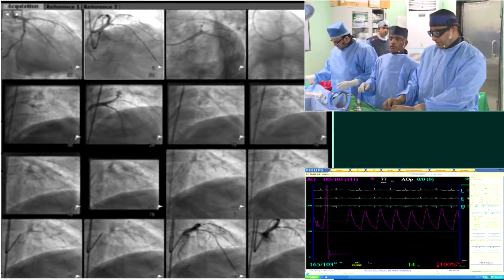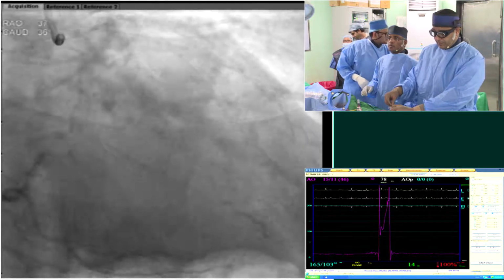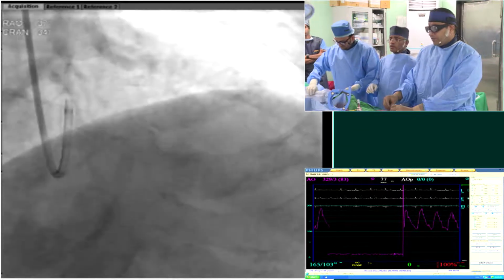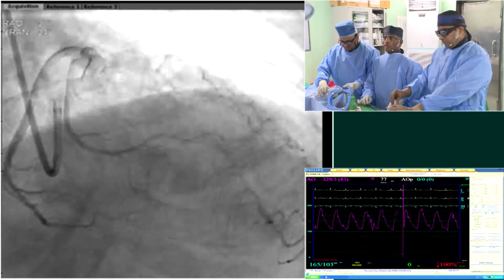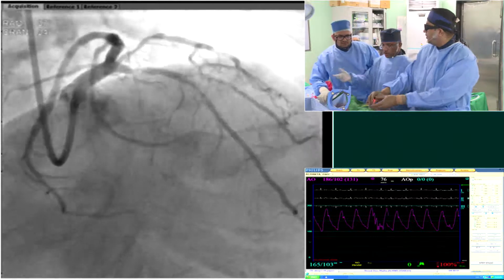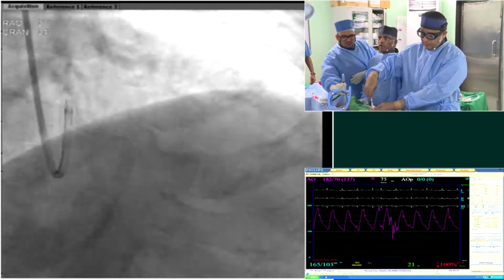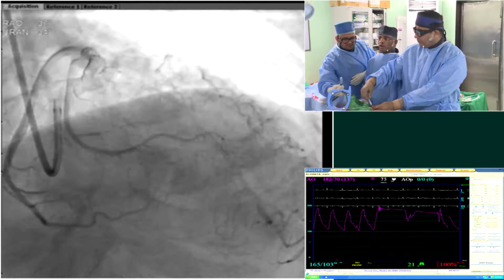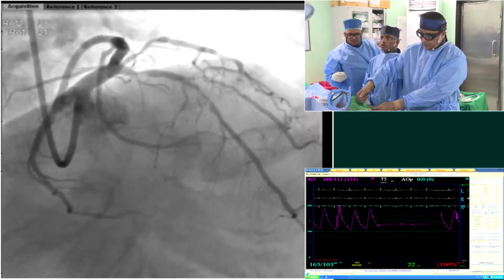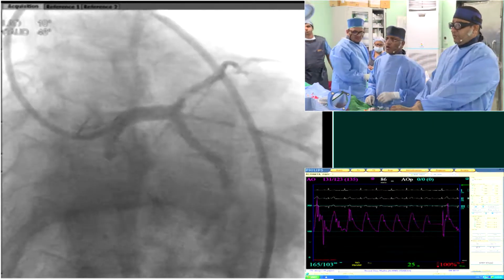The baseline angiogram shows a proximal LAD lesion which is almost 90%, and the LAD is highly calcified. The calcification is seen from the proximal to the mid segment, and there is involvement of the diagonal branch, which is also highly calcified and very angulated. The plan was to initially put a wire into the LAD and the diagonal. The LAD wire was easily placed with a regular Runthrough NS wire, but we tried to put a wire into the diagonal and, because of angulation and calcium, could not achieve it in spite of using the microcatheter and balloon support.